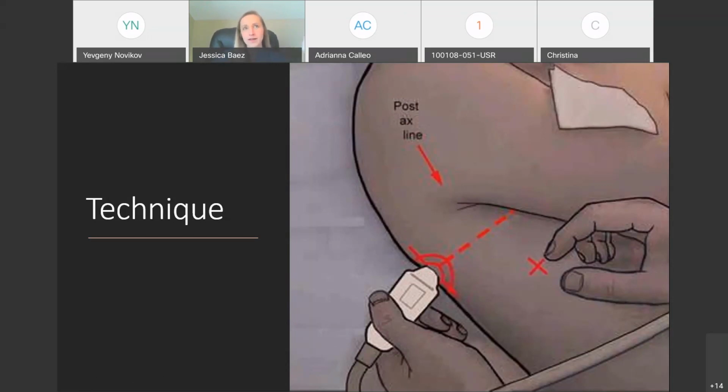In patients who can cooperate with you, it's great to actually scan posteriorly as well in order to detect things like a retrocardiac opacity or something like that. But there's plenty of patients, obviously, who can't necessarily sit up or participate with that kind of thing. So we don't always include it, but you can certainly increase your diagnostic accuracy if you scan posteriorly as well.